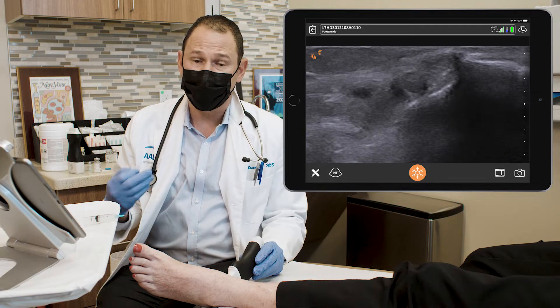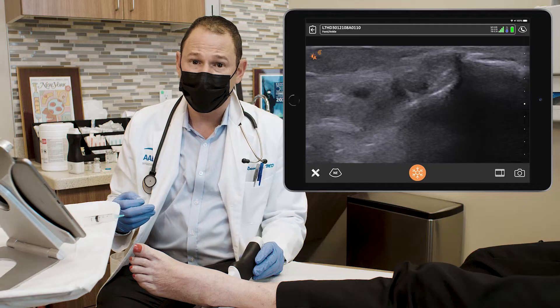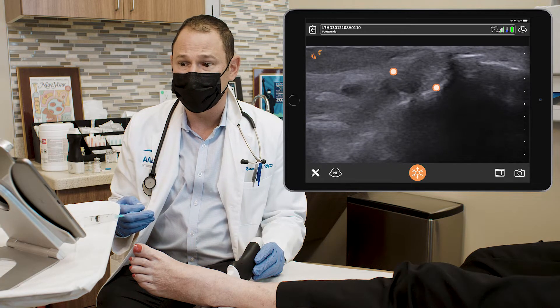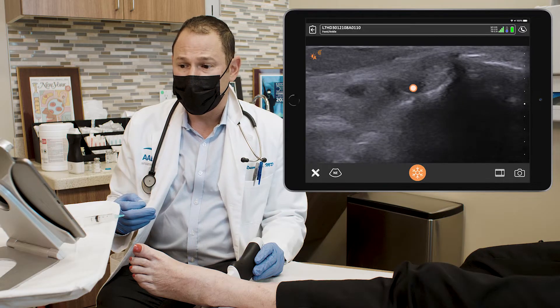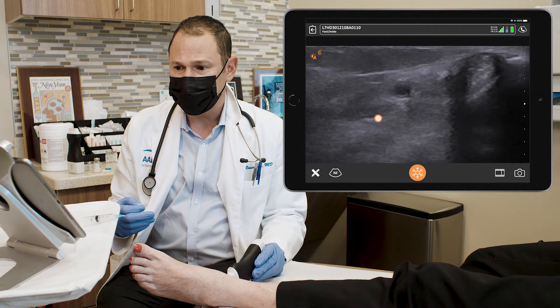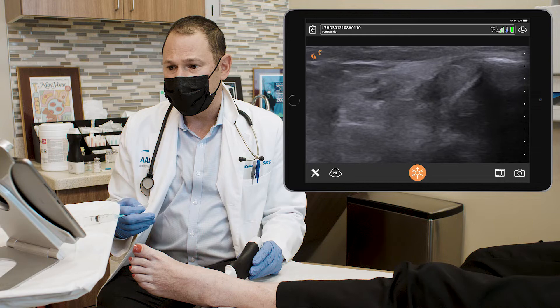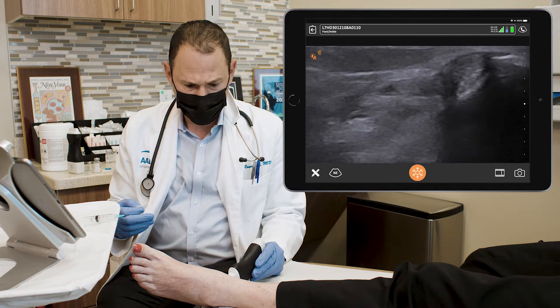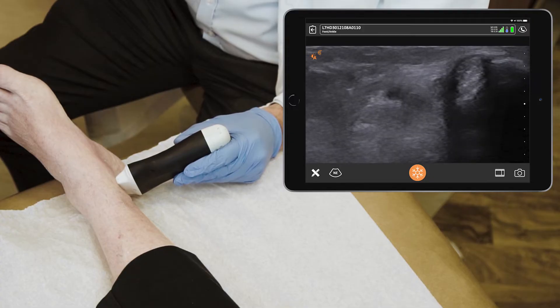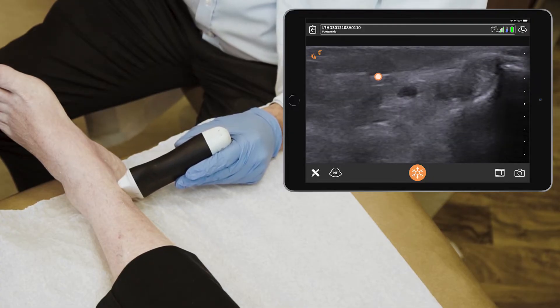Tarsal tunnel syndrome is basically the carpal tunnel of the foot. The tarsal tunnel consists of the tibialis posterior tendon, which is anterior, followed by the flexor digitorum longus tendon, then behind the artery it's the flexor hallucis longus tendon, and the nerve is next to the artery. The flexor retinaculum is visible when scanning between the malleolus and the calcaneus — it's the soft tissue above the blood vessel and the nerves.